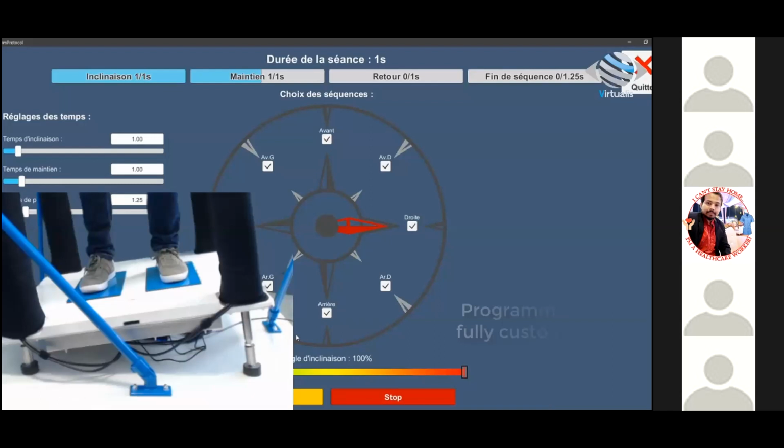So that's another key of virtual reality in vestibular rehabilitation, is to bring the patient outside of focusing on their balance. They have something else to do. They think about something else. And so you bring back balance as a reflex, what it should be. You don't have to think about your balance every day, because if you focus on balance, maybe you will be able to cope with the exercises. But when you slip on something, you won't have time to think about focusing on balance.